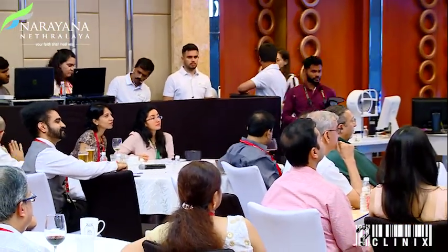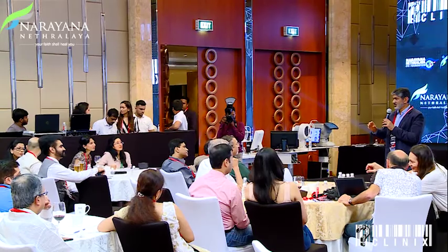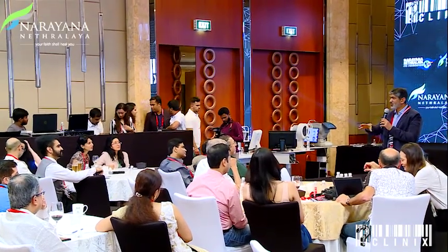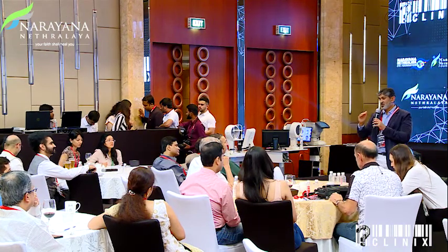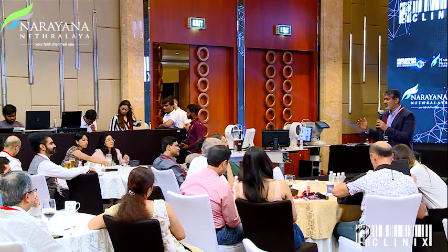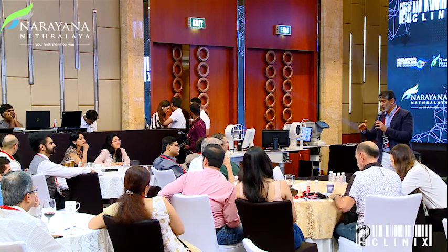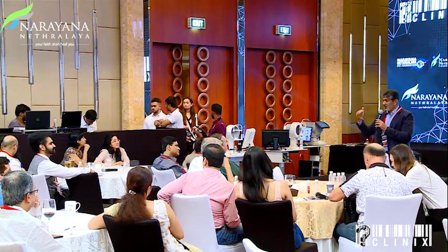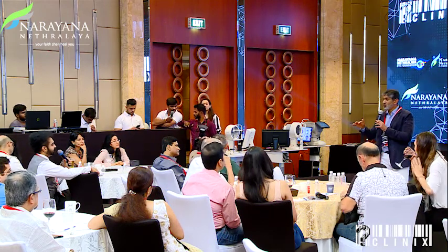You have to realize that this is a phakic eye. It is different from cataract surgery, where you remove the lens and you have a much larger space, about 4.5 plus around 3, almost 7 millimeters, whereas here you just have about 3 millimeters. You actually have half the space to manipulate. So when you start off, I think it is better to go by the company recommendation, which is 3.2. Above 3 is recommended.